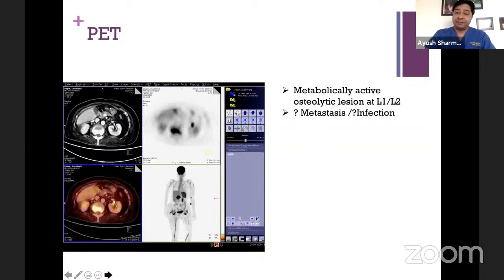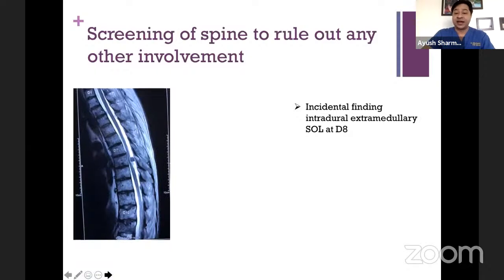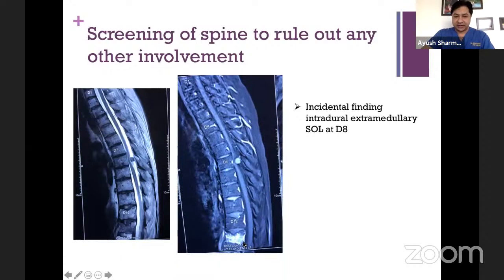So we also investigated it thoroughly, considering the history she presented with. There was no M band. We got a PET, and PET suggested that the only active lesion was L1 or L2. We always get a screening in this case just to rule out anything else. And to our surprise, we get a space occupying lesion at D8. You can see this is what she presented with here at L1, and there's a space occupying lesion at D8. Of course, neurologically it is intact, and we didn't find any sign and symptom of this lesion, but this was an incidental finding.